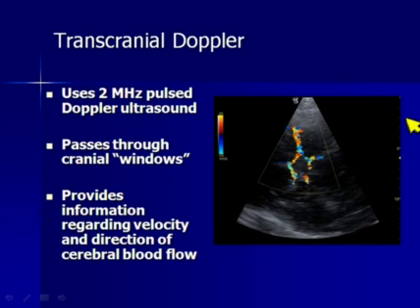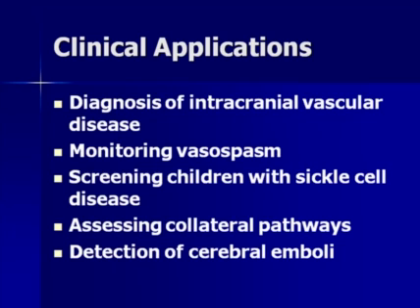There are certain windows in the cranium that allow us to penetrate and get some information. And transcranial Doppler really is all about looking at velocity and direction of flow. Now clinically there are multiple applications for transcranial Doppler.